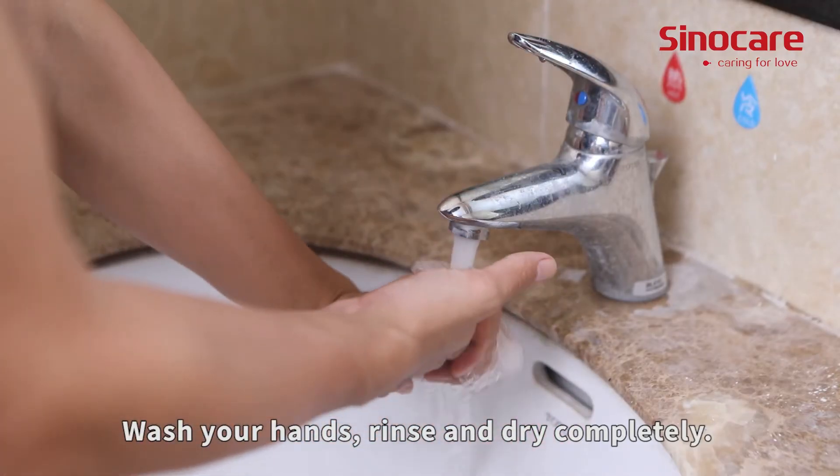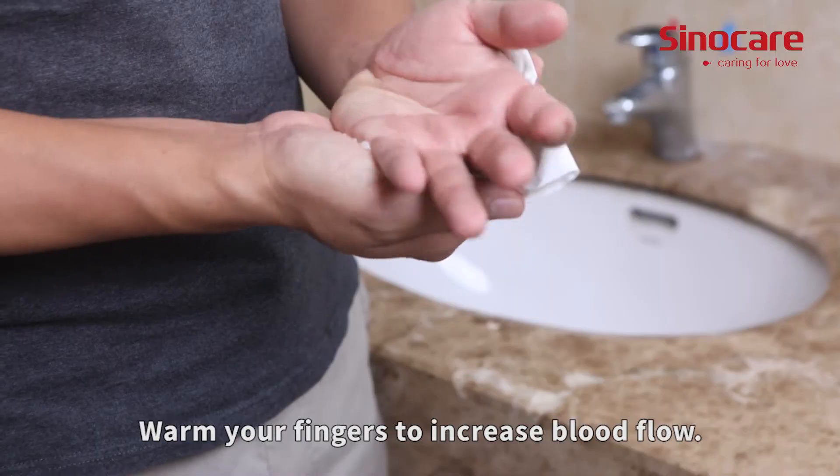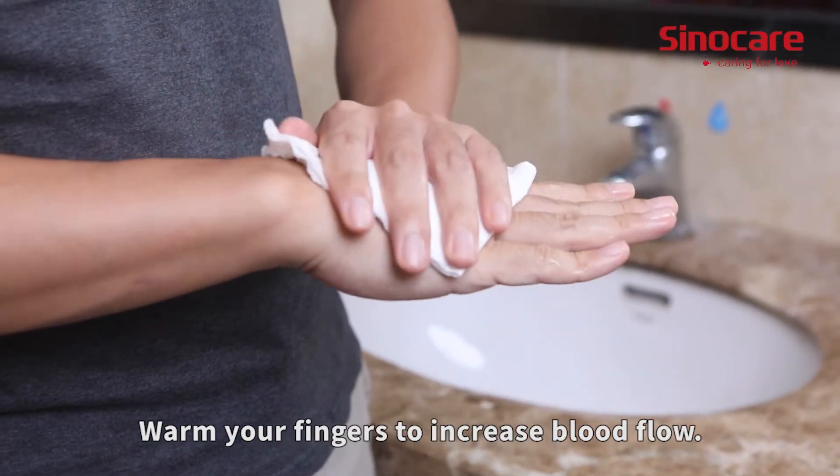Wash your hands, rinse, and dry completely. Warm your fingers to increase blood flow.